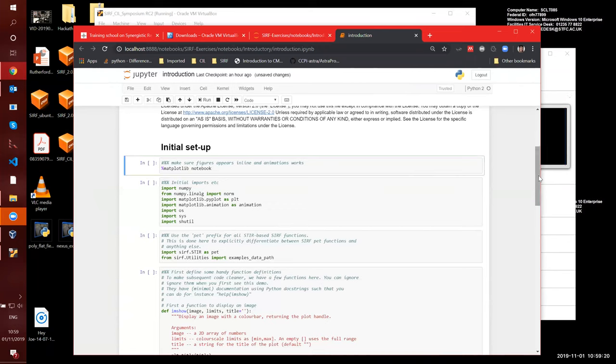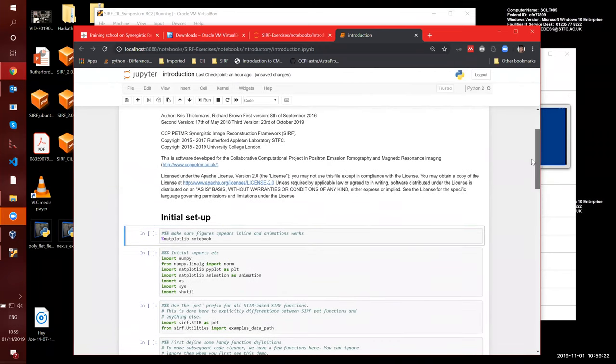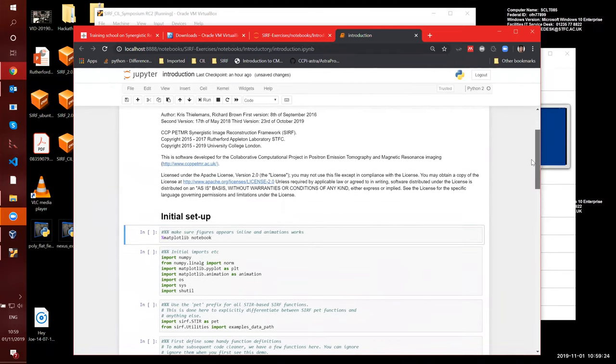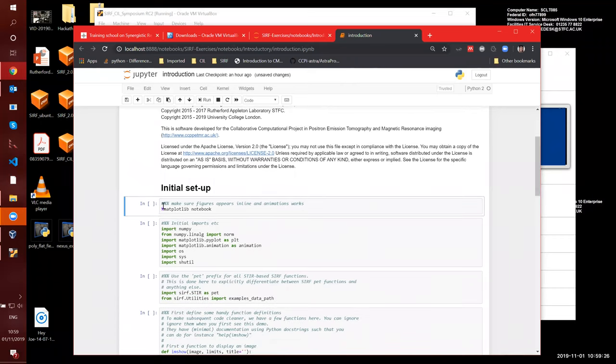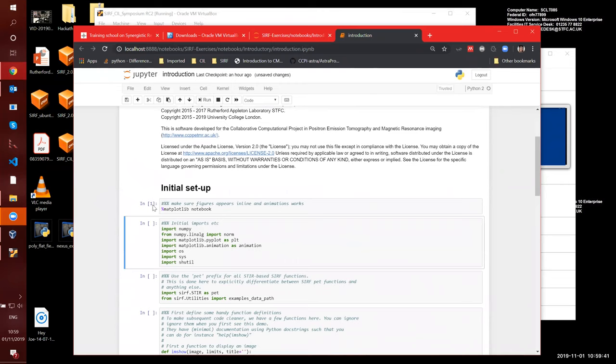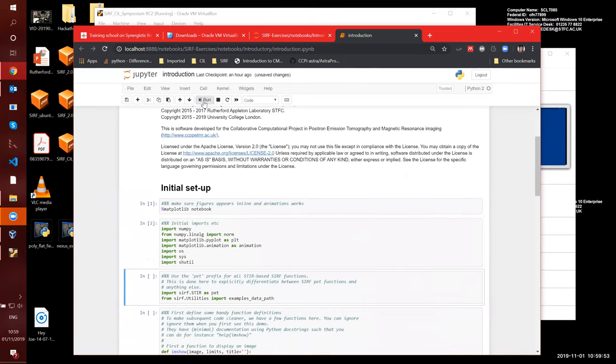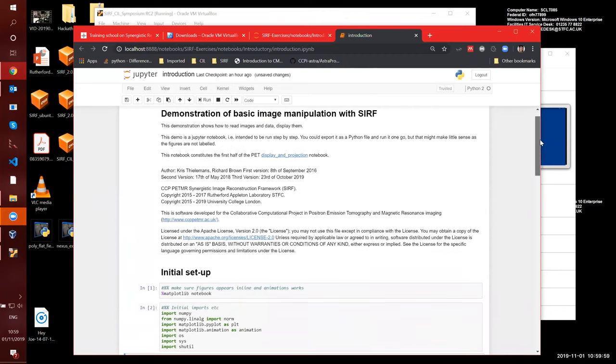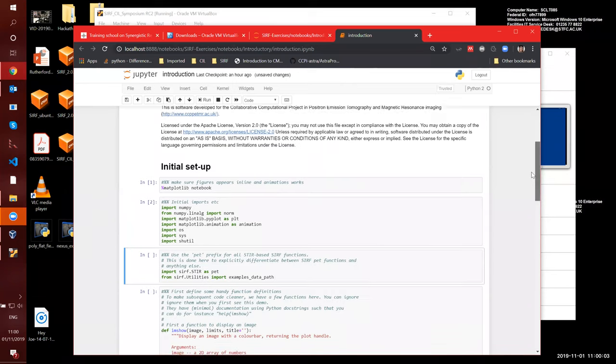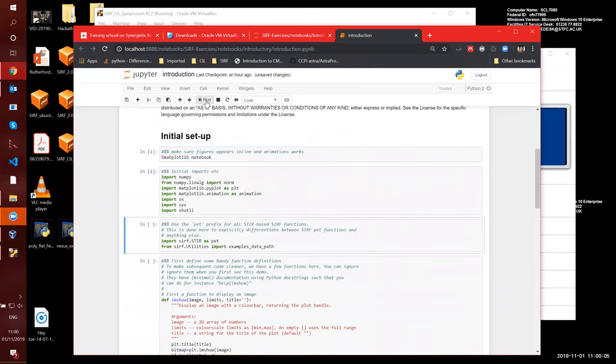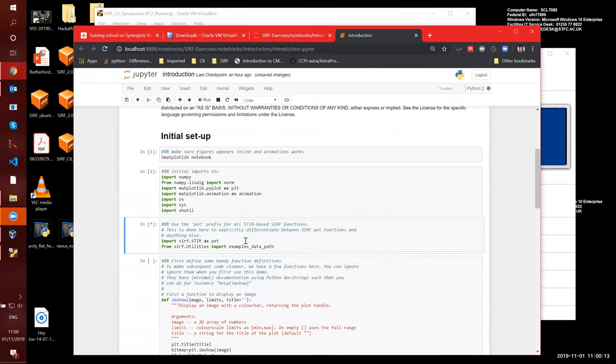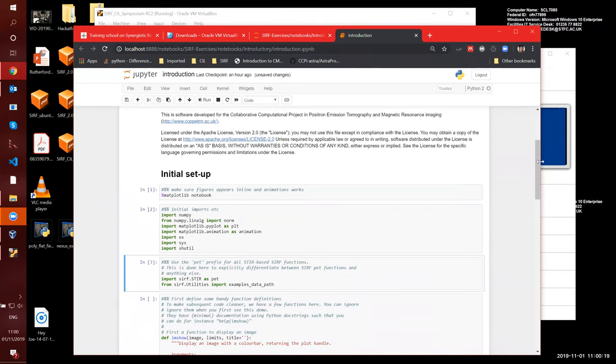When you start a notebook, fresh in your case, you will have this status. You see in code cells, you have this in, I don't know what it means, and square brackets, empty inside. This means that this cell has not run yet. If we run it, it will have a star for a while and then a number. So when the star is present means that the cell is running. If it has a number, it means it has run. And the second cell that runs will bear number two. So I hope that's sufficiently clear. So the idea here is that you read the text and the code and you execute by clicking this button or I think control. So by selecting the cell, control enter will run the cell. Yeah, so that's about it.